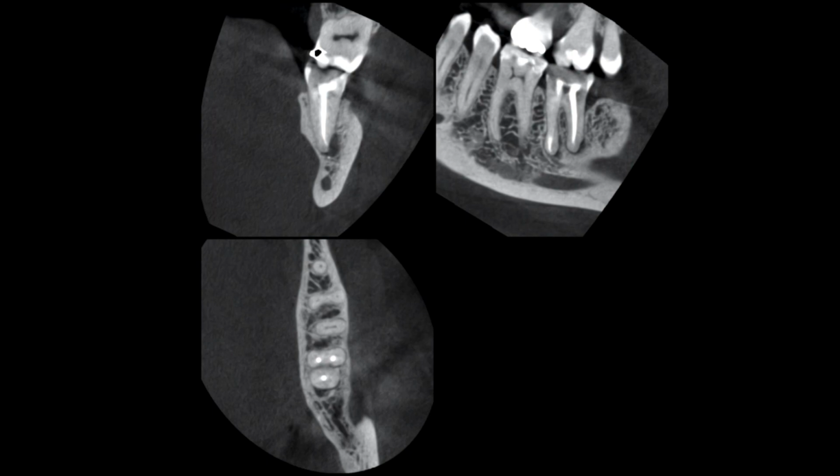A small volume CBCT was exposed in this case primarily to check whether any root canals had been missed, as the previous root filling looked quite good on the periapical radiograph. CBCT is not a reliable way of checking for cracks in teeth, however you can see things on the image that may indicate that there is one.